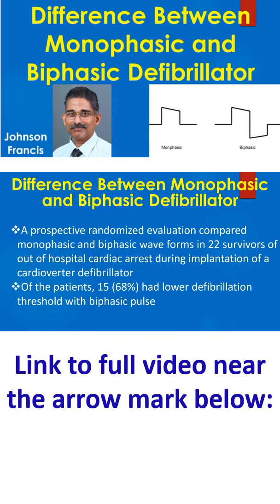A prospective randomized evaluation compared monophasic and biphasic waveforms in 22 survivors of out-of-hospital cardiac arrest during implantation of a cardioverter defibrillator. Of the patients, 15, that is 68%, had lower defibrillation threshold with biphasic pulse.